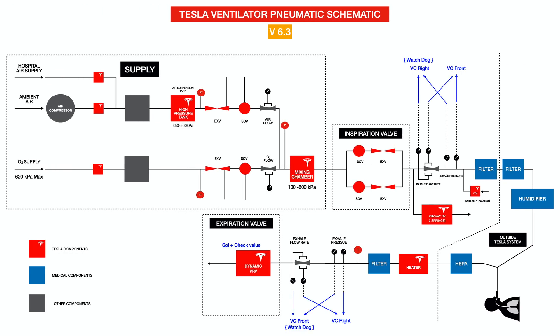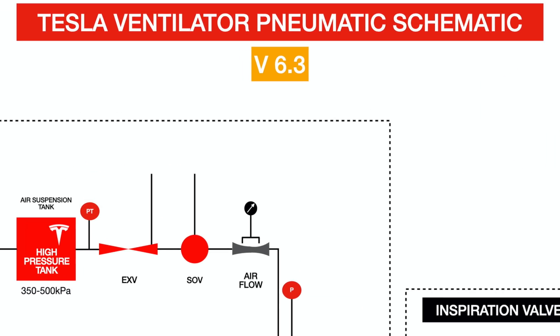They showed a schematic of what their ventilator efforts have been thus far, and there are a few things which struck me as interesting that I wanted to highlight. I took the liberty of faithfully recreating their schematic so that it's much clearer to see. Right off the bat, you can see that this is version 6.3 of the schematic, so they have not been sitting idle — the Tesla team has been working really hard to bring this to life.